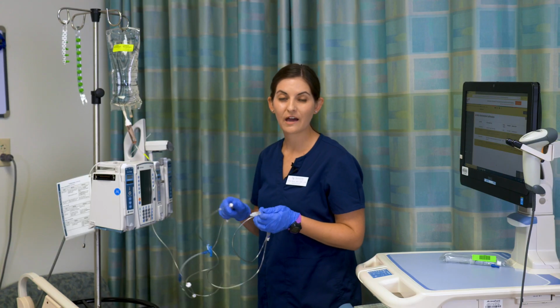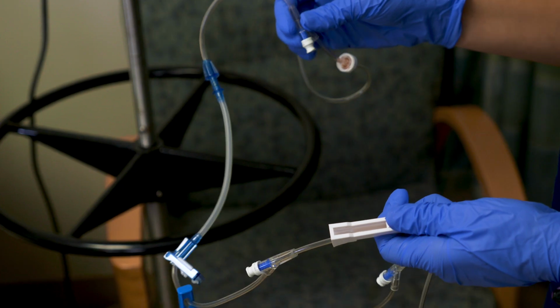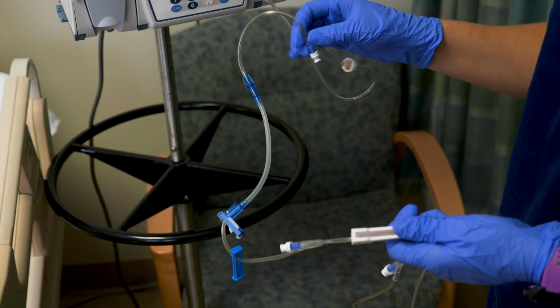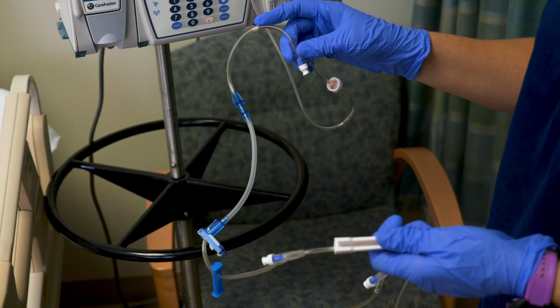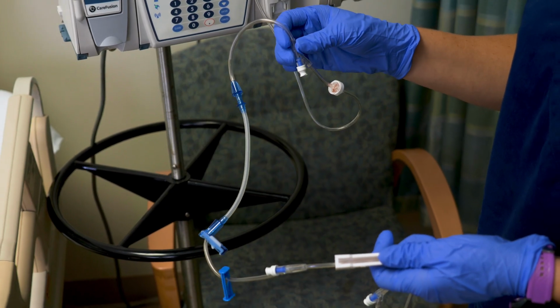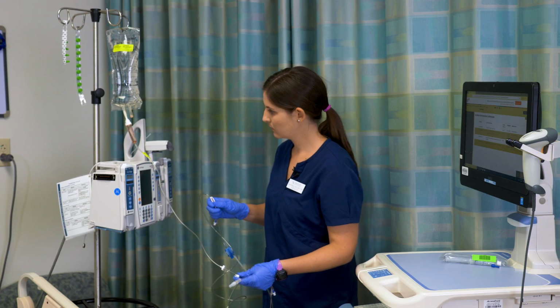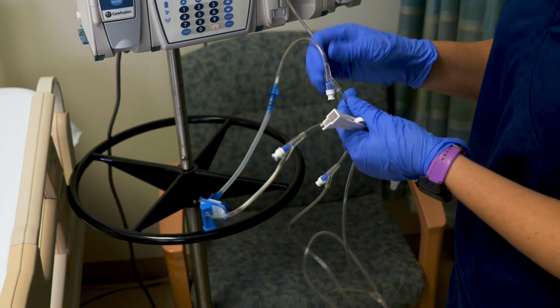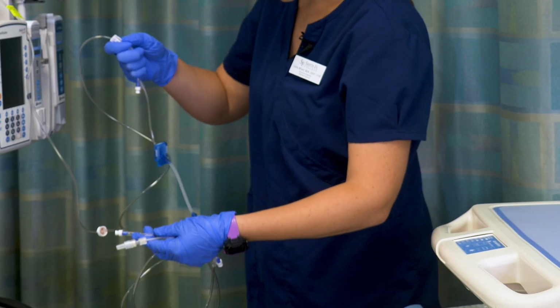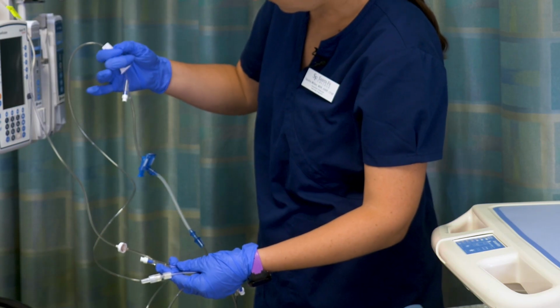In order to control how quickly your tubing is primed, you'll want to use the roller clamp. A little tip to make sure you reduce the number of air bubbles is to hold the injection ports upside down as you prime them. So I'm going to slowly release the roller clamp. Hold my injection port upside down. I make sure the next ones are upside down as I go through the tubing.